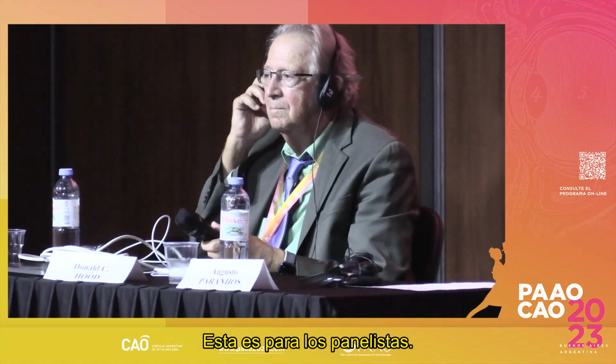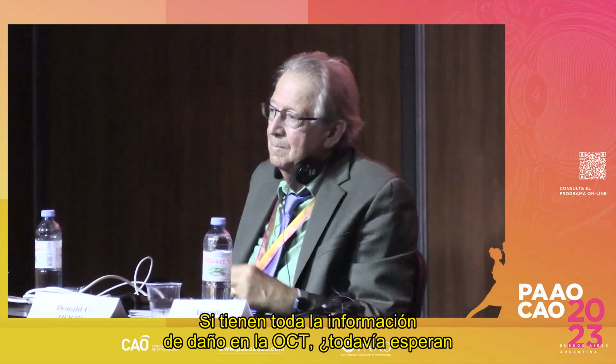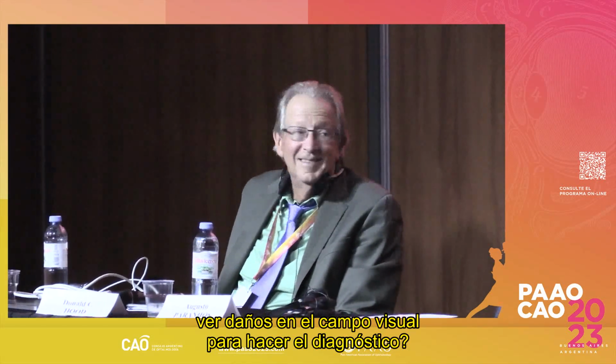So this is for the panel. So if you have all that information of damage in the OCT, do you still wait to see damage in the visual field to make the diagnosis?